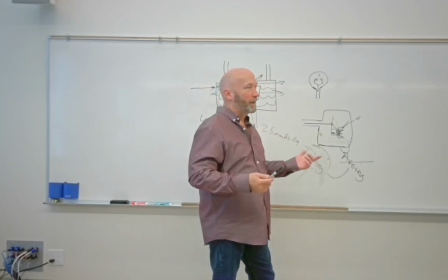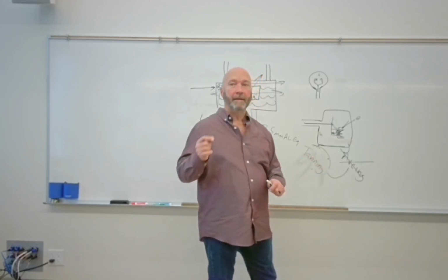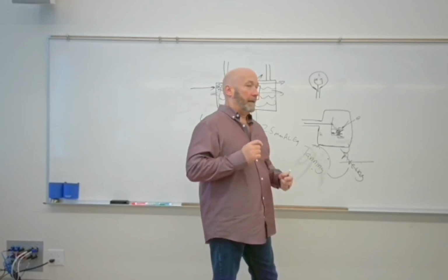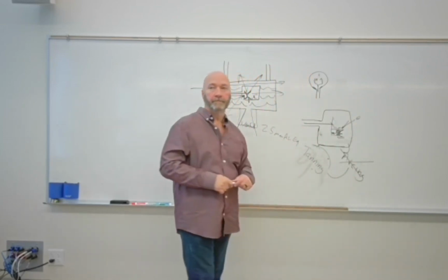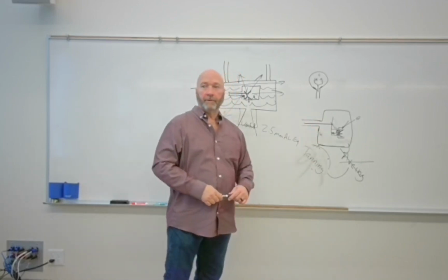Okay, so that's one of the few ways that your tube theoretically could die that might not be directly related to heat, is that you just may lose electrical connection to your focusing cup somehow or another, right? You lose sharpness, recorded detail, that very well could be the issue.